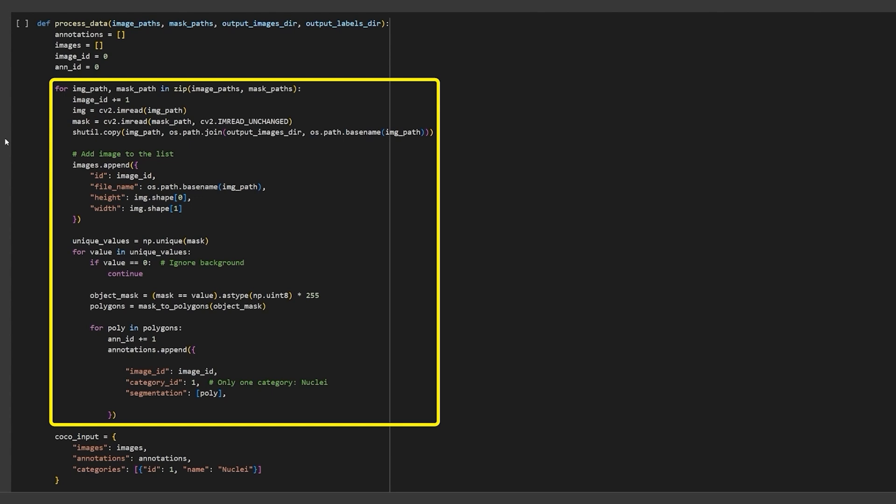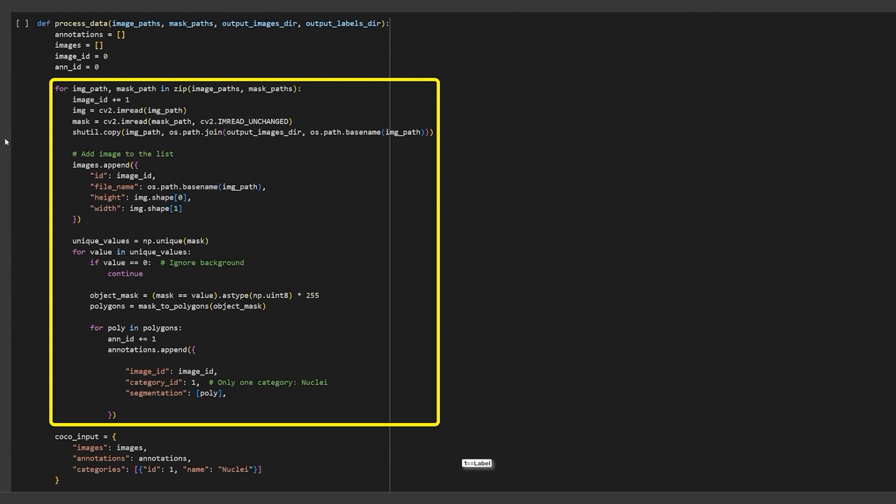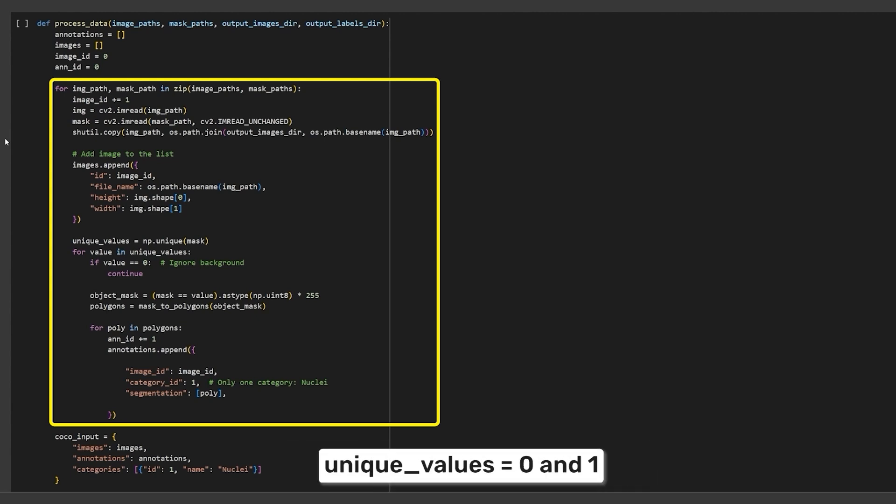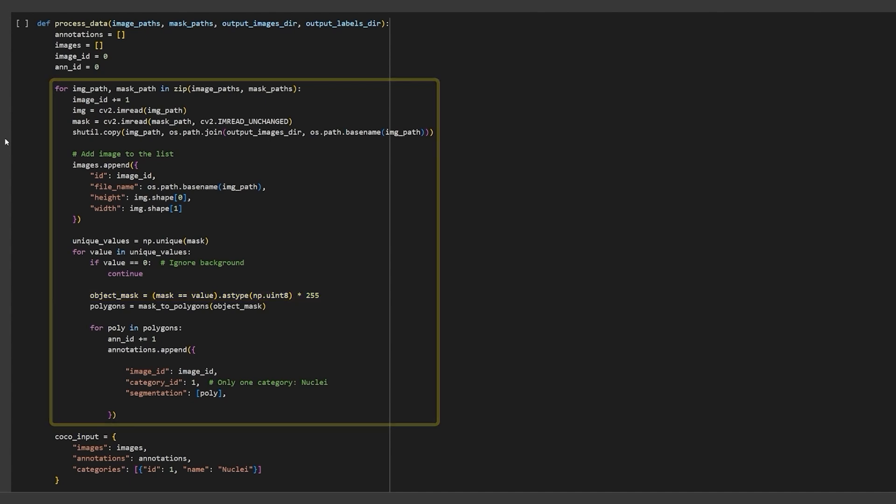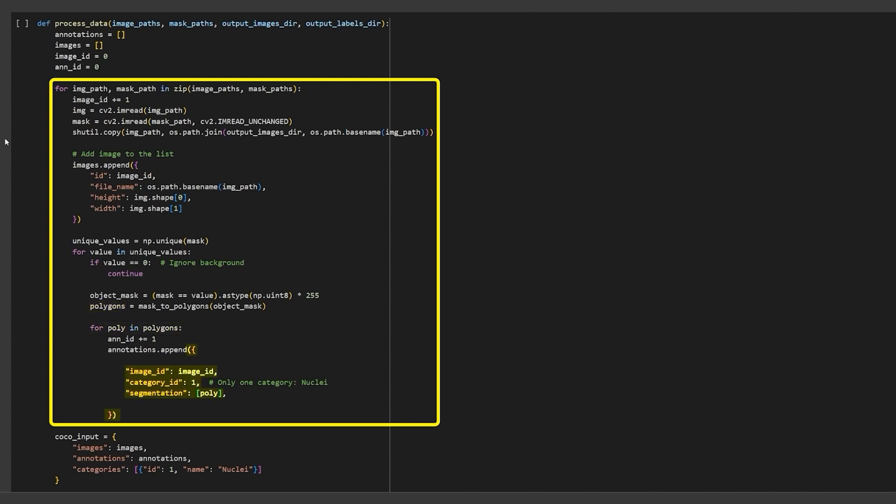Loop through the images and mask paths and append a dictionary with the image metadata to the images list. Next, we find all the unique values in the mask. This will be 0 for the background and 1 for the label. Hence, our unique values will be 0 and 1. Loop through the unique values. If it is 0, skip it. Otherwise, wherever it is 1, multiply it by 255, thereby creating a black and white blob-like image. Now, pass this mask to the function maskToPolygons which will return a list of all the valid contour coordinates. So, for each contour in the mask, append the annotation information to the annotations list.